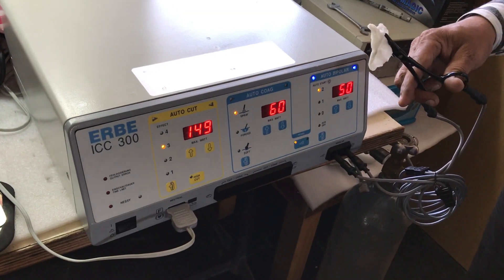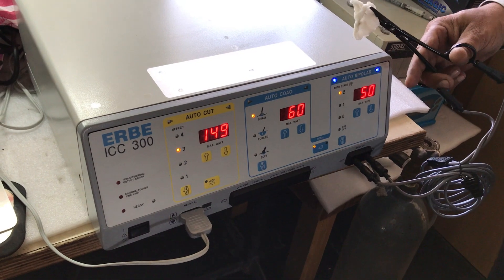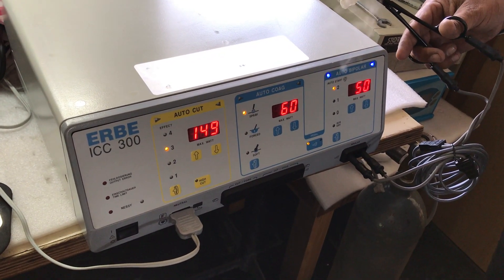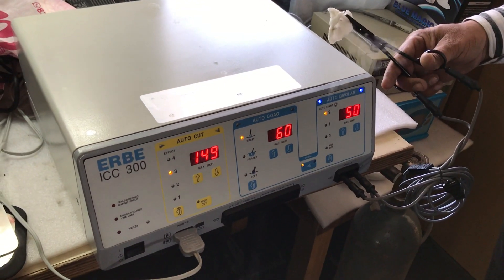This is the RBICC 300, and similarly the function for the RBICC 200 is the same — the functioning of the ports, that is the bipolar and the monopolar ports. That's how the bipolar port functions.